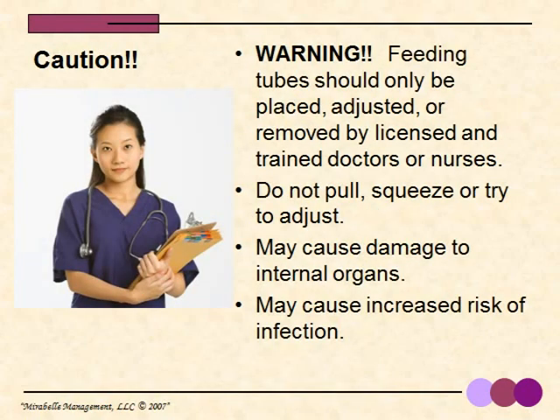I want to caution you that feeding tubes should only be placed, adjusted, or removed by licensed and trained doctors or nurses. Pulling on the tube, squeezing, or trying to adjust a feeding tube by the patient or a non-trained individual can cause a number of problems and risks. There can be damage or tears to one's internal organs near the entrance point and an increased risk of infection.